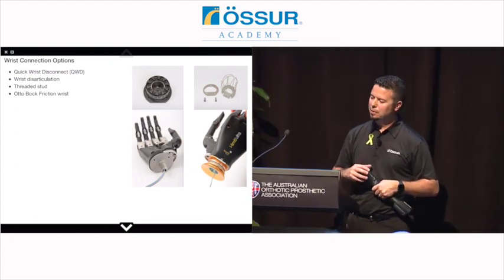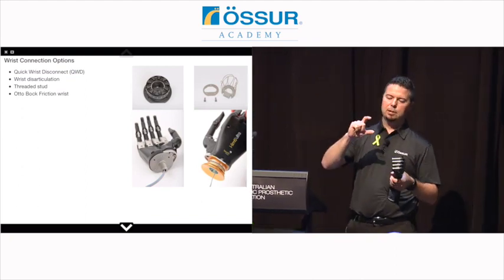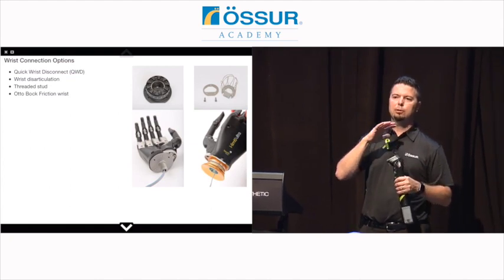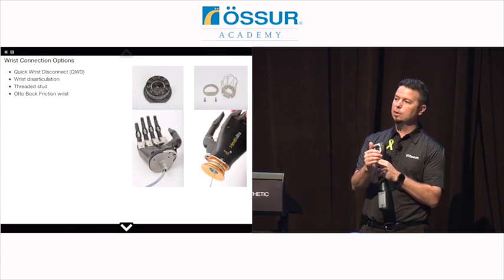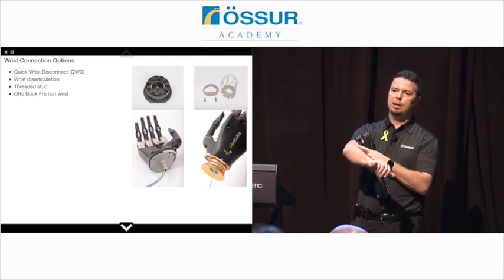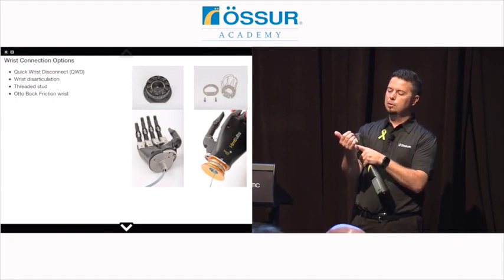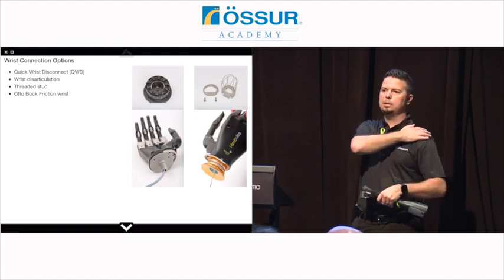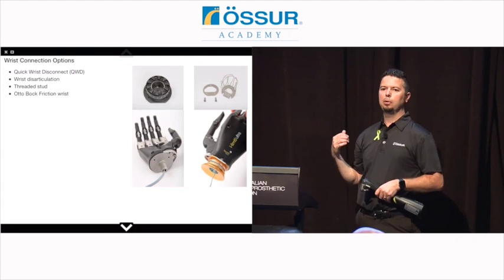And then the last one, the lower right, is a friction wrist. It adds just under an inch of build height, but allows pronation and supination. This is a great option if you have a long transradial or even a wrist disarticulation level where you can't preserve that anatomical pronation and supination within the prosthesis. Use that friction wrist, they'll still be able to pronate and supinate. You'll really help avoid that compensatory motion that would be necessary from the shoulder and elbow and torso.